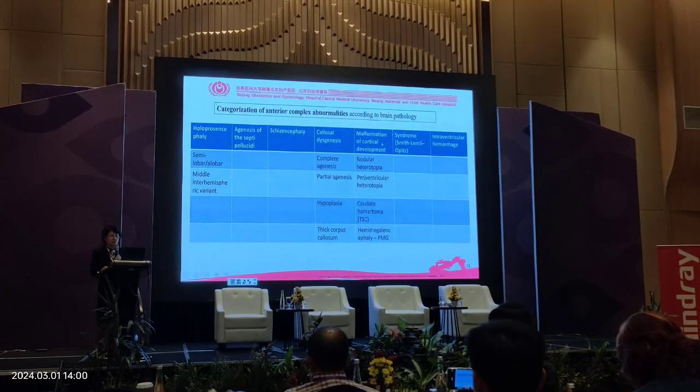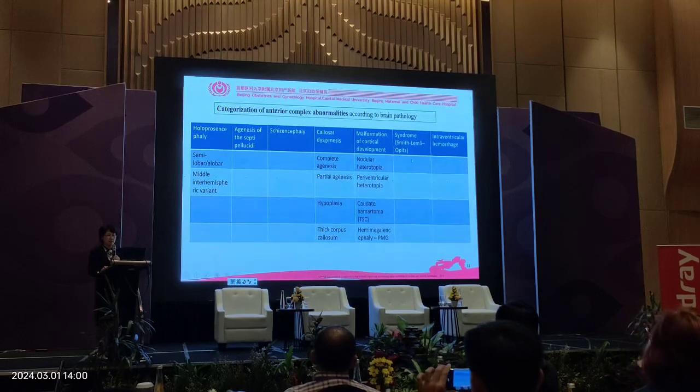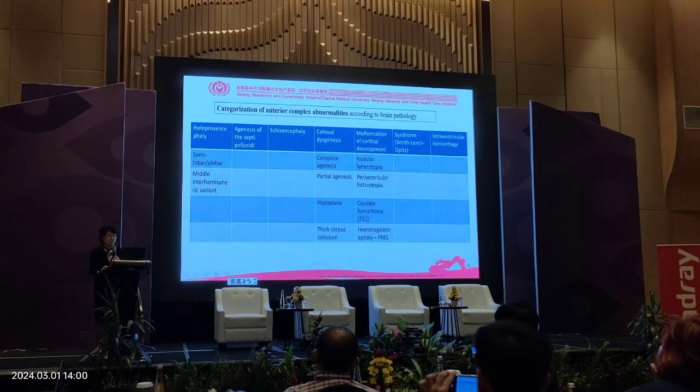Also, we should find malformations of cortical development, including periventricular heterotopia and other syndromes, like Smith-Lemli-Opitz, and intraventricular hemorrhage and other diseases.